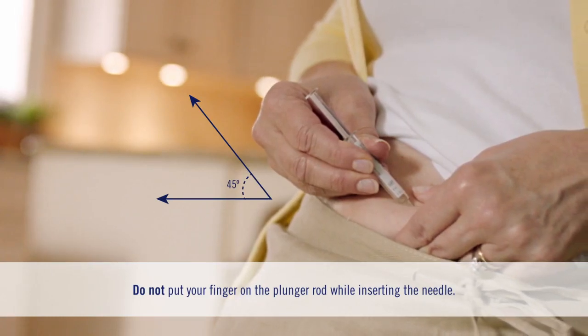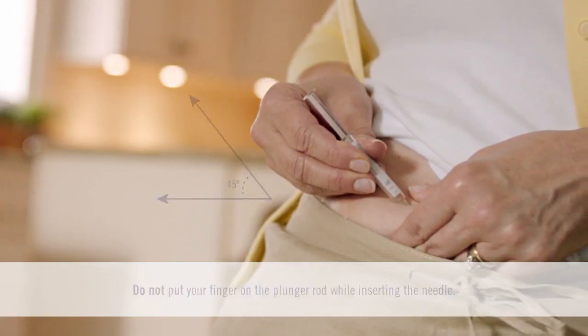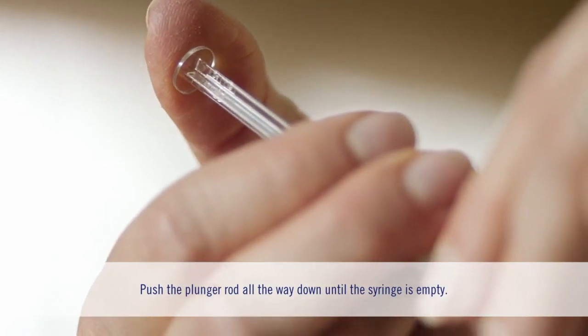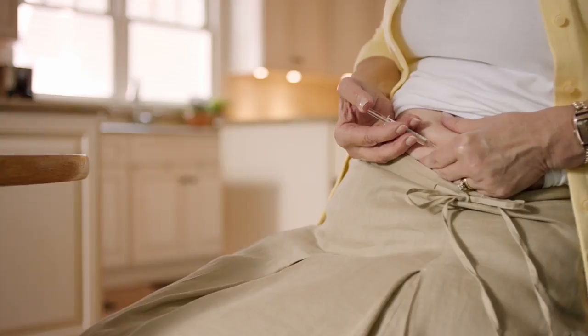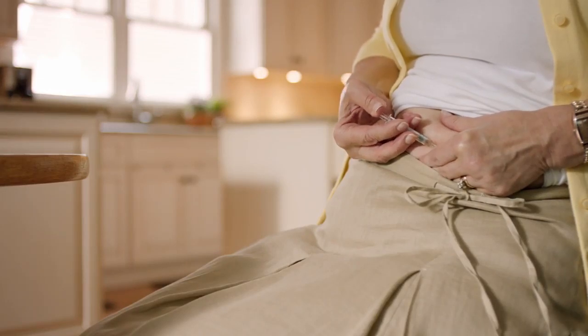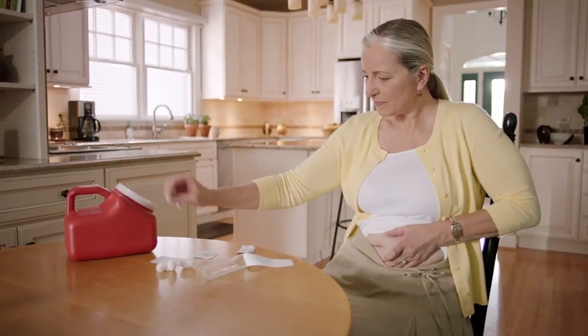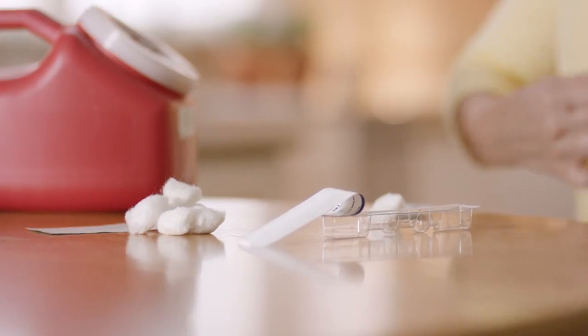Keep holding the pinch as you insert the needle into your skin at a 45 to 90 degree angle, like this. Using slow, constant pressure, push the plunger all the way down until the syringe is empty. You may have to push the plunger harder than for other injectable medications you may have taken. Now lift your thumb off the plunger and gently lift the syringe off your skin. You're done injecting.